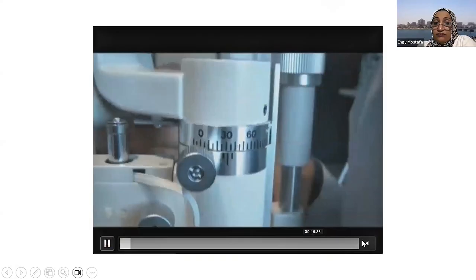We cannot leave out the applanation tonometry. The applanation tonometry is a commonplace step in slit lamp examination. We have to use fluorescein dye, and of course we have to use the cobalt blue, so we are changing, and we have to make it a slit beam, and of course after putting anesthetic. And here we are using uniocular vision as well.